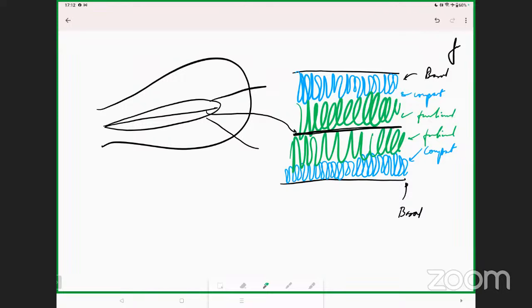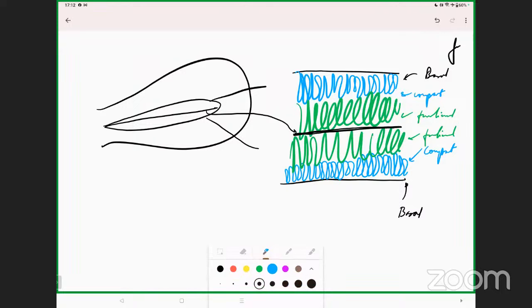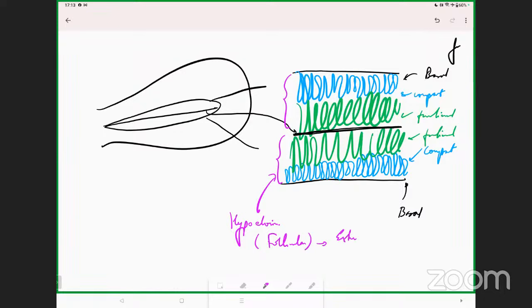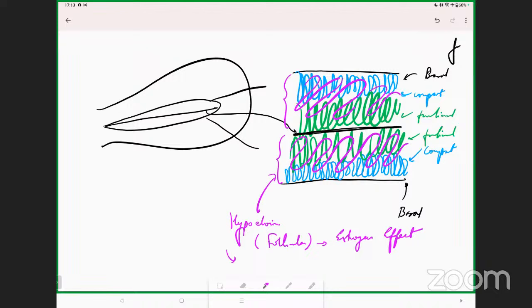What is important to understand is that we are predominantly looking at a hypoechoic endometrium — it is going to appear absolutely black when it is in the follicular phase or under the effect of estrogen. We are also looking at this entire thing getting hazy whenever it enters the secretory phase, and this hazy or secretory endometrium represents estrogen plus progesterone effect.